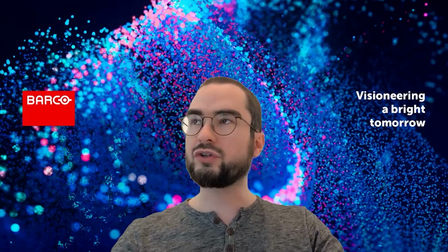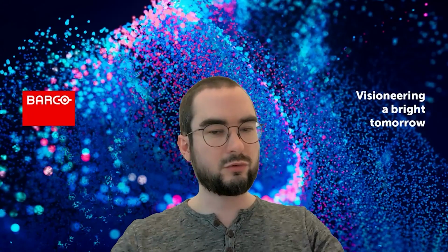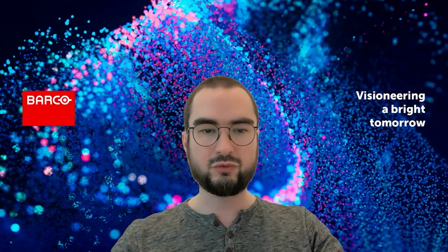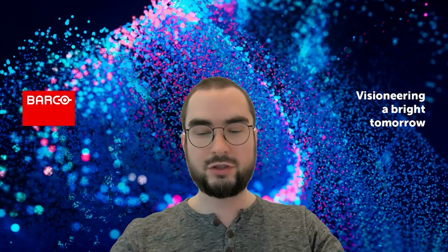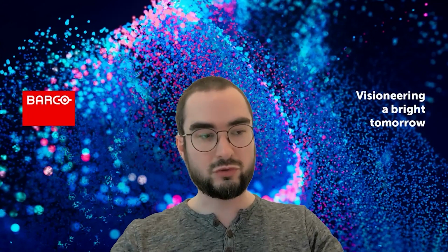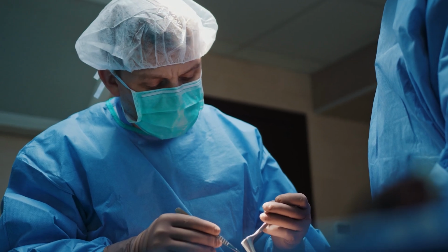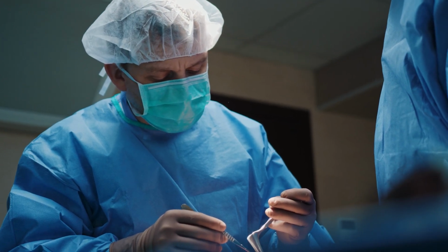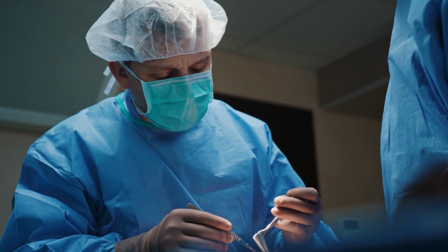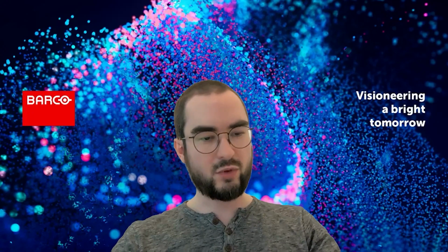When you prepare your surgery, let's take a liver resection, for example. You want to resect the liver, but you do not want to do any damage to any of the veins that you don't need to, or you do not want to puncture the stomach while you're going to it. For a surgeon to really understand that well, they need depth information. They want to make a mental map of where they're going and where they need to be.